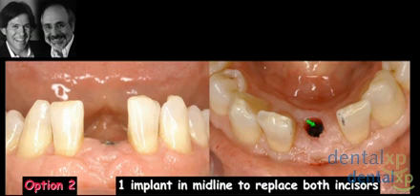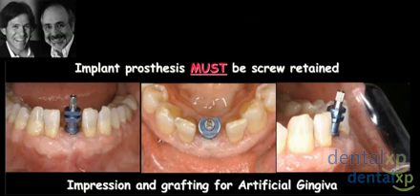Now, David has to work out the aesthetics utilizing one implant rather than two. This is another option that we think is quite important. So we're going through the process over here of impressions and grafting. And you'll see, when you talk about grafting, when we're talking about artificial gingiva, we tend to graft buccally, knowing we're not going to get all the way vertically. And we like to get an added bonus of soft tissue, lots of volume of soft tissue.